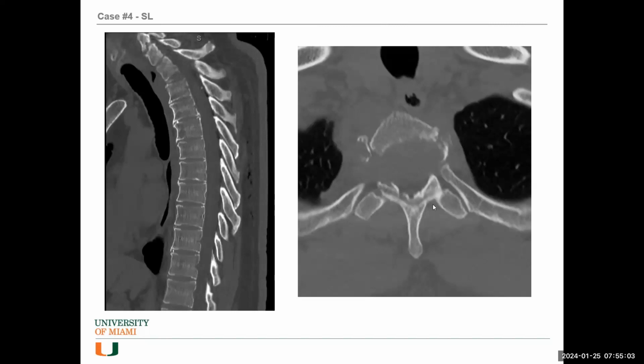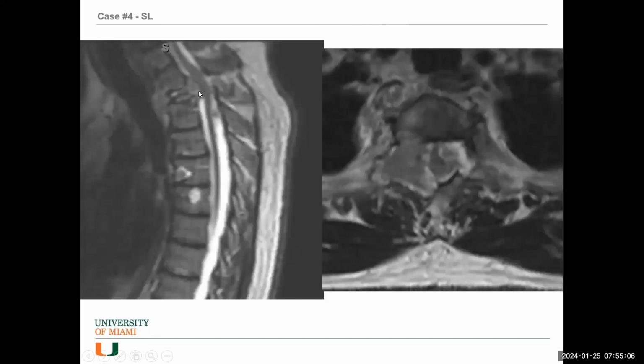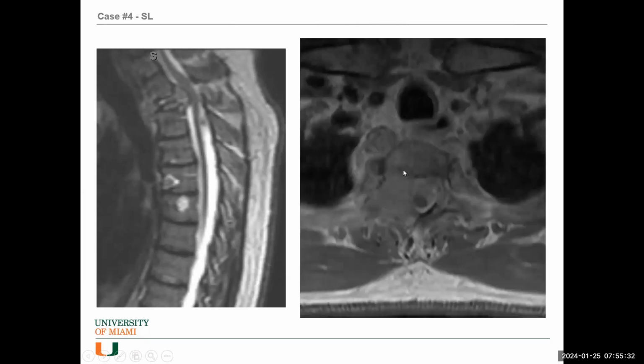There's some component of epidural tumor, and you can see this is the MRI that was done. Very significant retropulsion of both bony elements as well as tumor. We don't know what it is quite yet. It involves a pedicle. There's epidural enhancement. This would be what's called an epidural spinal cord compression score of 3, circumferential, causing significant compression. That's like the Bilsky score. You can look that up on your own. Again, contrast enhancement, spinal cord is basically being squashed. This guy needs surgery.